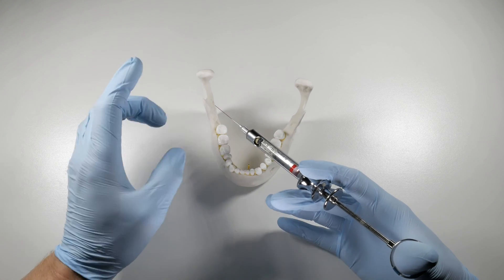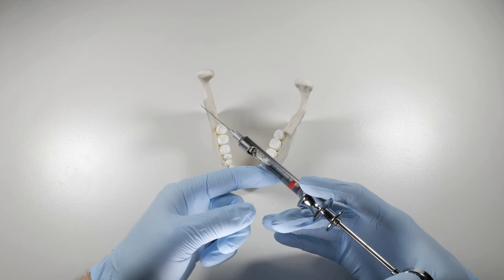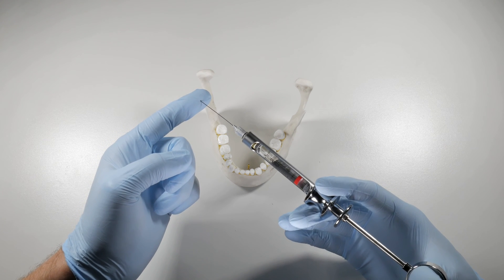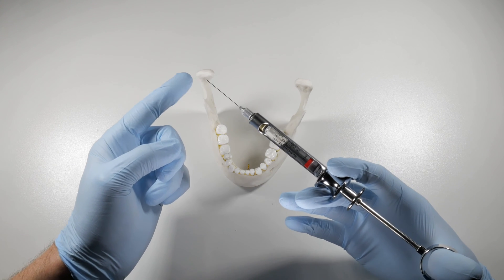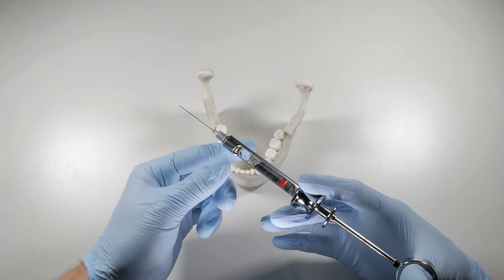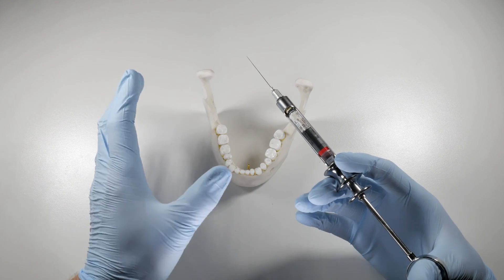I said 'chances are' because we may actually be in a vessel and get a negative aspiration — a false negative. The reason for this, though it's kind of rare, is that the bevel on our needle, as it goes into the vessel, can actually rest against the vessel wall. As you pull back on your plunger, the vessel wall is sucking in, occluding the lumen of the needle, which prevents any backflow of blood into your carpule. So you may aspirate thinking you're in the clear, deposit your anesthetic, and get an intravascular injection without even knowing it.